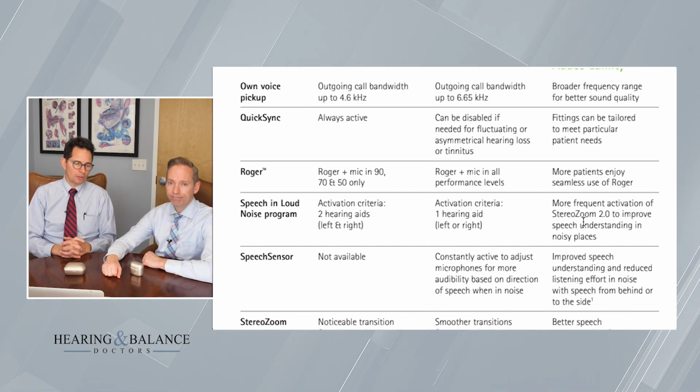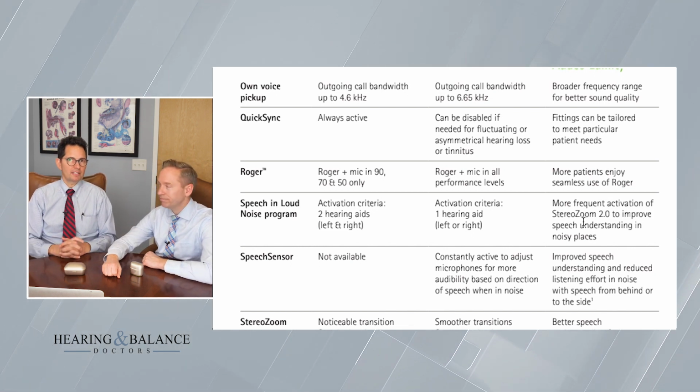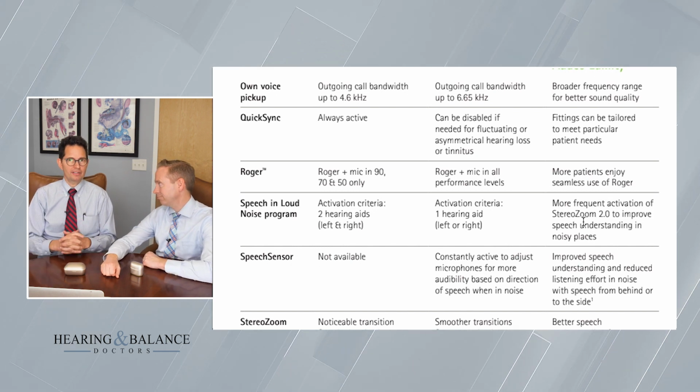Yeah. And so as we talk about the Paradise and the Lumity, both of these have been excellent with pairing up with the Android Bluetooth phone. So, looking at how much we've appreciated the advancements between the Paradise and the Lumity, one thing that is a little bit interesting is on occasion we get an individual whose anatomy, their ear canal, is larger. It's a bigger volume. And with the Phonak devices, and it doesn't matter if it's the Paradise or the Lumity, that's one thing that's been a little bit challenging: we have to watch the anatomy of the patient, because if the canal's too big inside, it's like the sound doesn't quite get to the eardrum in quite an efficient way.